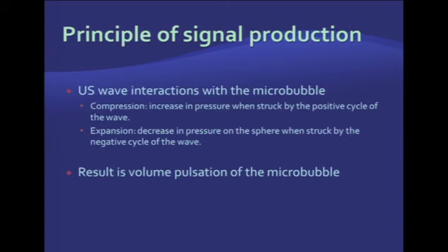Let's review the principle of signal production. When an ultrasound wave hits a microbubble, it will compress and expand depending on the cycle of the ultrasound wave, producing a volume pulsation that can be detected by the ultrasound system.